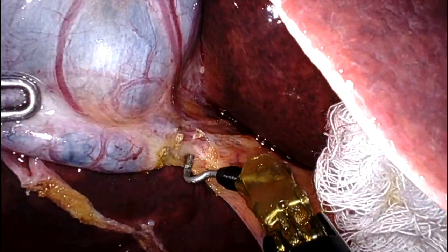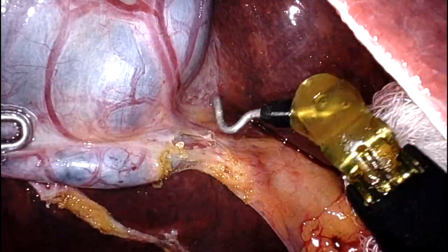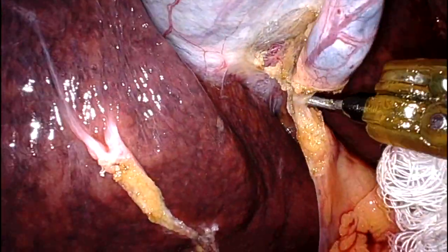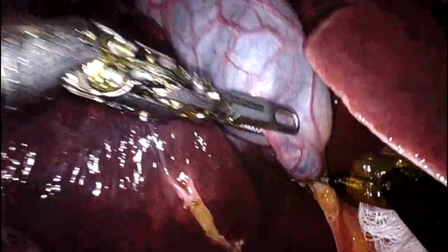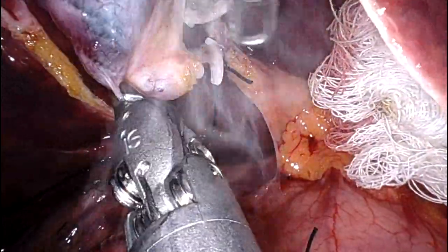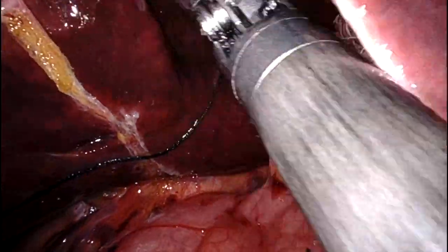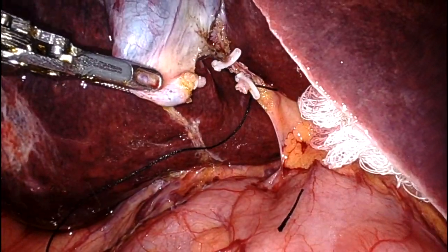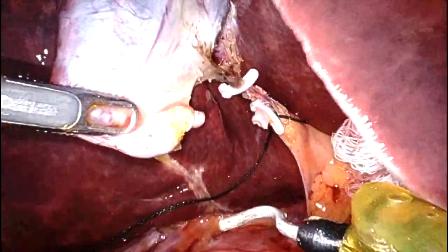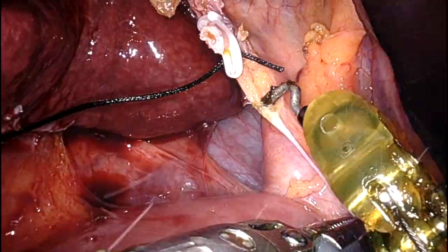Started here with cholecystectomy — standard dissection of the cystic duct and artery, critical view of safety. I divided the cystic duct and placed a tie on the cystic duct stump for the assistant to later pull on it. Gallbladder was completely removed.